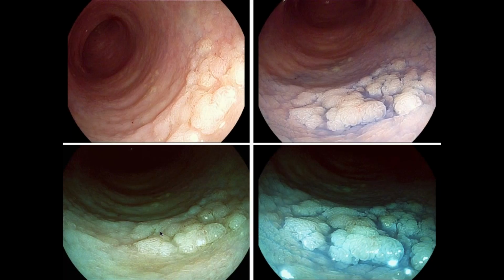And now I give you an example of how many faces the colonic lesion in IBD can have. You can have this flat, non-polypoid lesion, and you see here in white light high definition, and then you see it in dye chromoendoscopy and virtual chromoendoscopy. The dye chromoendoscopy gives you more definition of margins, but virtual chromoendoscopy gives you more definition of vascular pattern, and so you can predict invasiveness.